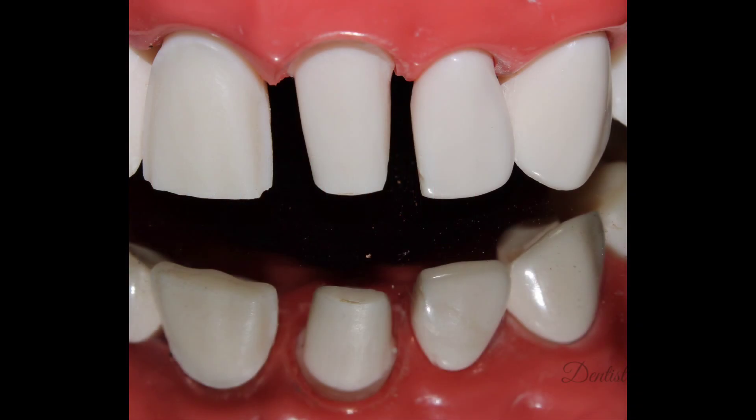After finishing the entire preparation using a fine needle diamond with a yellow color coating, the final preparation should have no undercuts, smooth surfaces, no sharp line angles, 1 mm width of incisal thickness, 2 mm height reduction on the incisal aspect, 6 to 12 degrees taper on the interproximal surfaces with 2 mm axial wall height, and a lingual fossa reduction. I hope this video was helpful in understanding the all-ceramic preparation for a maxillary central incisor.